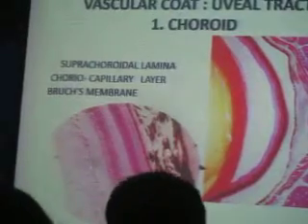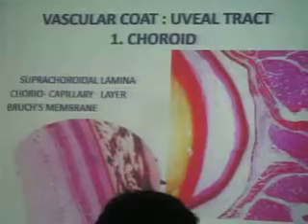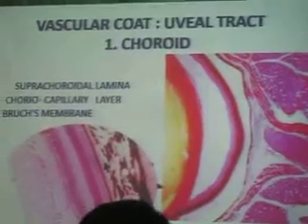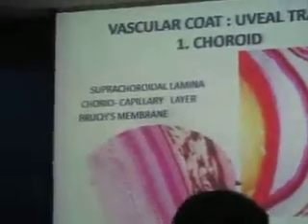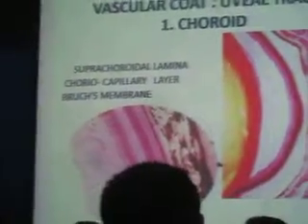And then of course, you have the avascular, the acellular layer, which is your Bruch's membrane. Pag membrane, lagi medyo acellular. Okay? It's either you have the basement membrane or the cellular part. Okay? So Bruch's membrane is for the choroid, and the Descemet's and the Bowman's for your what organ? Cornea. Okay?